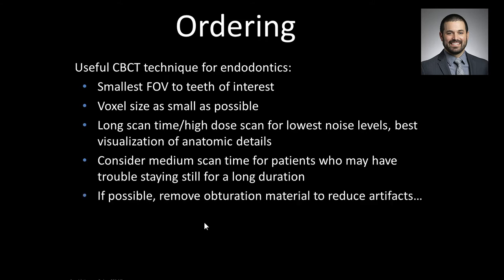And the endodontic residents always roll their eyes whenever I bring this up, but if you really need to see what's going on inside of a tooth, fracture-wise or accessory canal-wise, and the tooth is previously treated, you have to remove that obturation material first. That's going to get rid of quite a bit of artifact that is otherwise inevitable associated with that obturation material, and let you see a little better. But I understand and I know that's a lot of work and not commonly done.